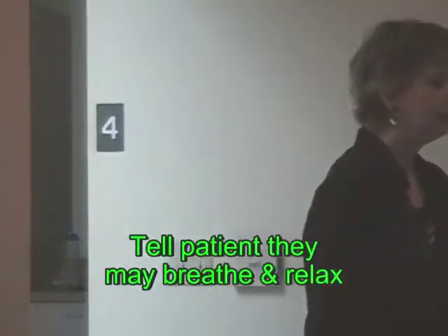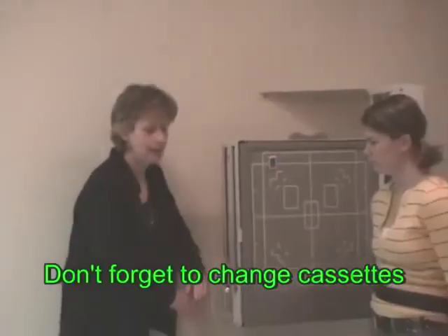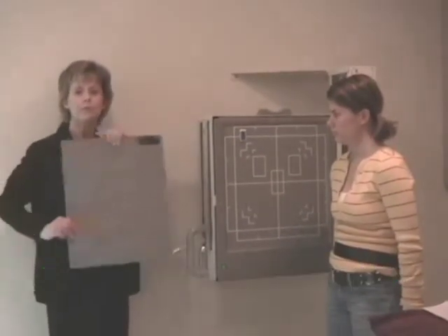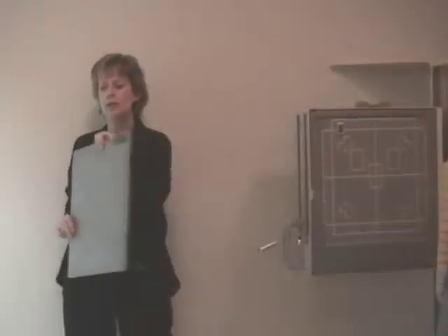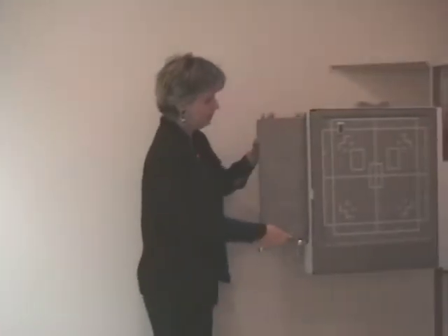And then she can relax, because that's not a comfortable position to hold, especially when you're a beginning student. It takes you longer to position a patient. You want to build up your speed because you don't want your patients uncomfortable. Do not forget to change cassettes. Okay? We made this exposure. You'll take it to the safe place and get a new cassette and put it in the wall bucky.